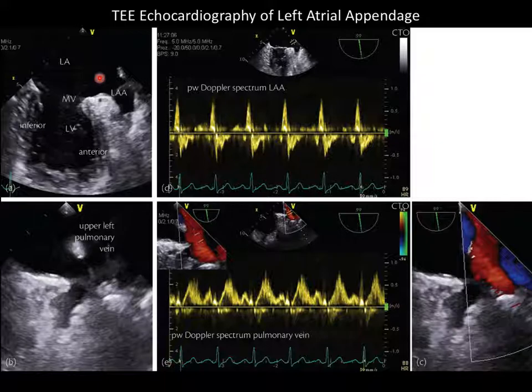of the brain. So you don't want static blood in this chamber, and so oftentimes they take Doppler to look at the velocity in and out of that chamber. Now, I've looked at this in some detail with a little bit of research with CT and looking at the echo data. These data are really not that reproducible. So while they take these measurements, the correlation of these measurements to how much blood actually gets ejected out of that chamber is not that great. We can look at that in some detail if you wish.